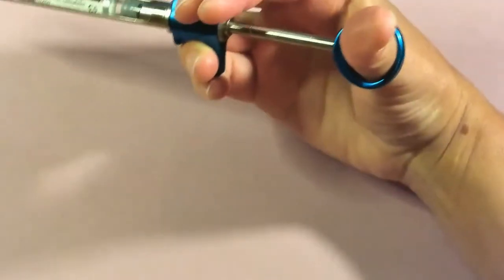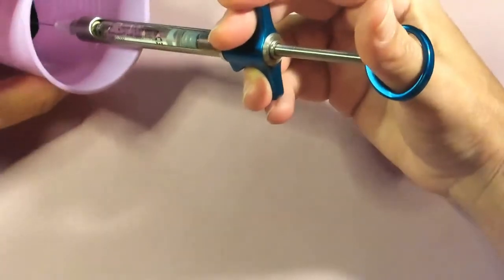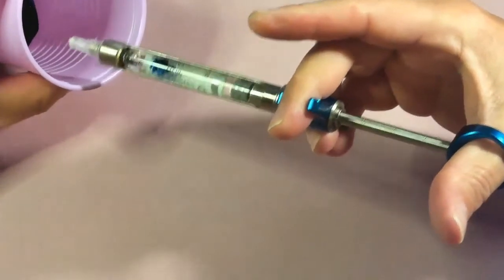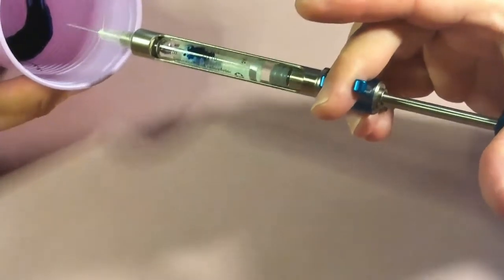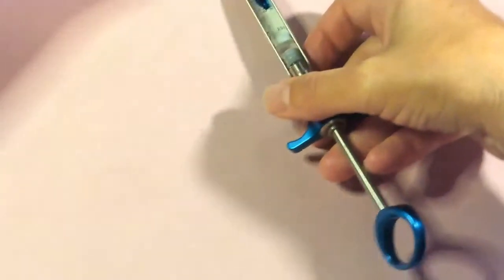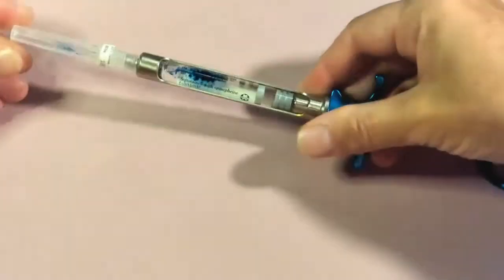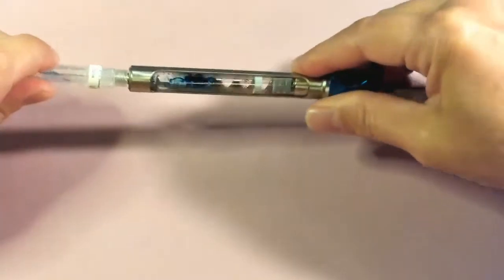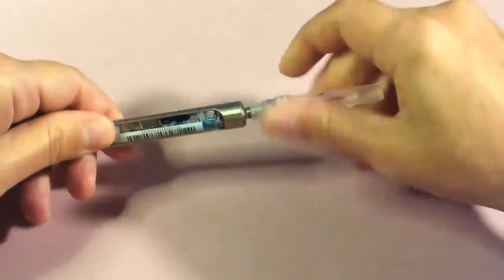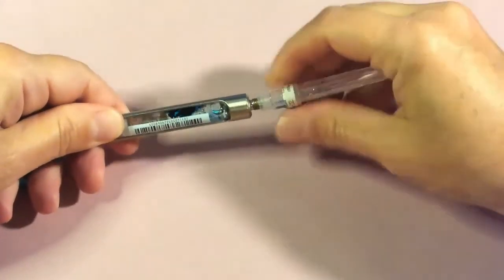You can see what a positive aspiration looks like — that's roughly what it appears. With actual blood, it tends to mix with the anesthetic and blends more, gradually filling the cartridge. If that happens, come out of the tissue, remove your needle, and change out your cartridge. You want to change both the needle and cartridge at that point because you could have blood in the lumen of the needle and get a false positive.